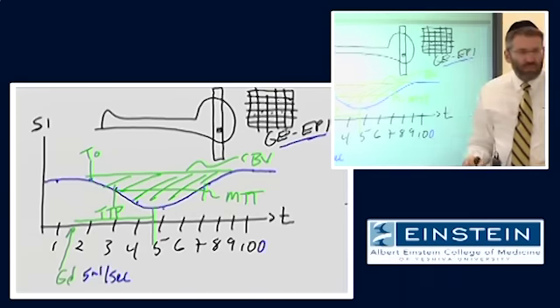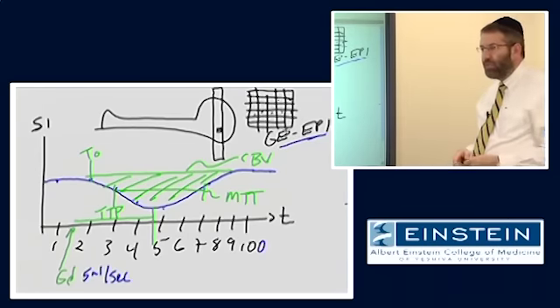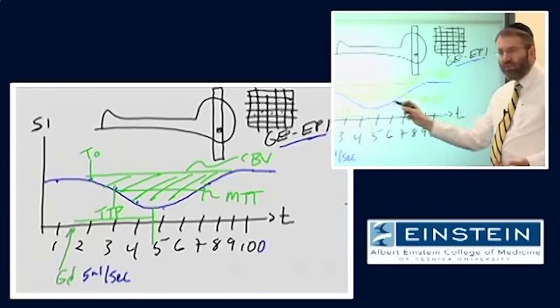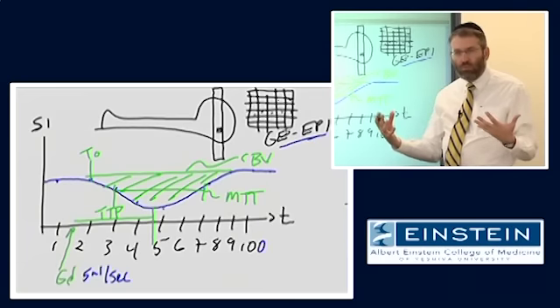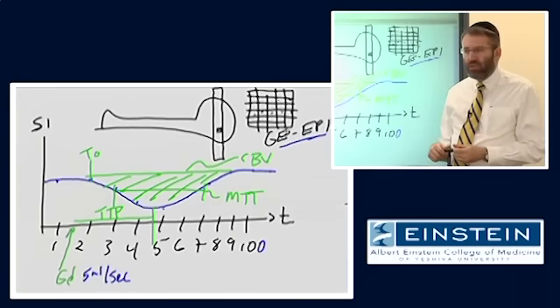And each of these pieces of information can be used to make different diagnostic inferences about the patient. If you're looking at a tumor, for example, the cerebral blood volume is very important because aggressive neoplasms generate their own blood supply and have a higher intravascular volume than normal brain tissue.